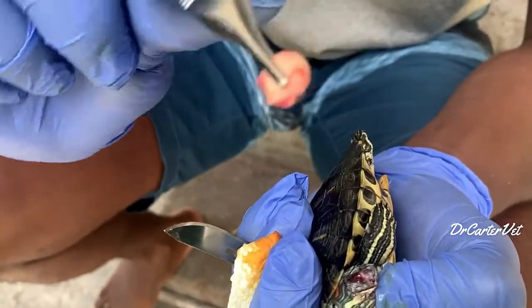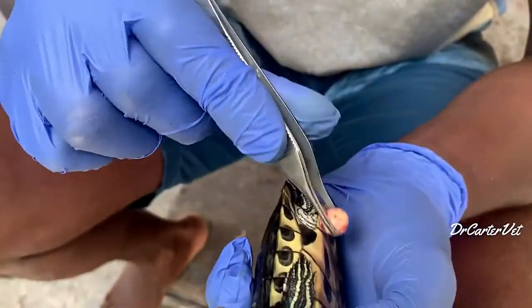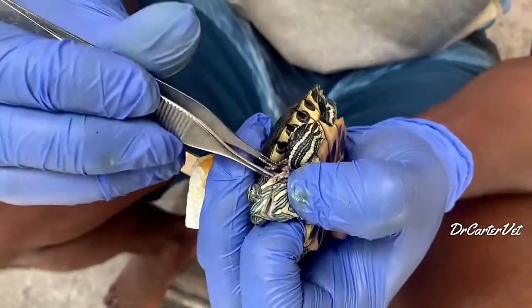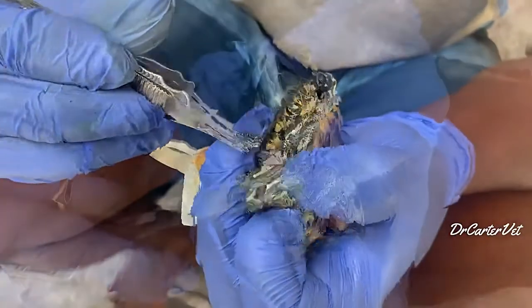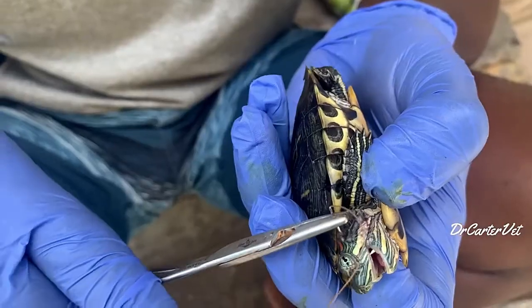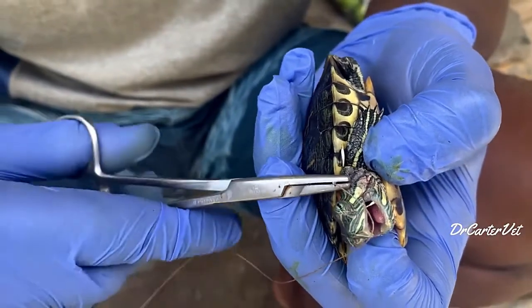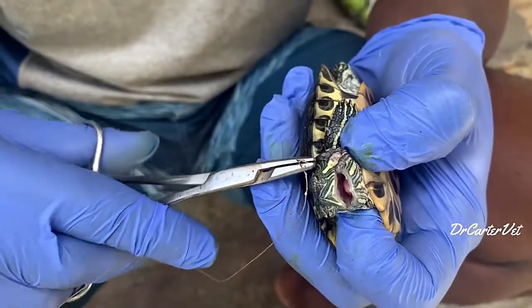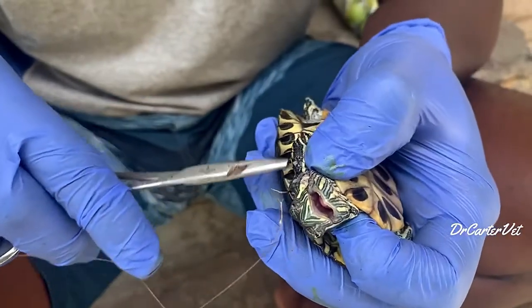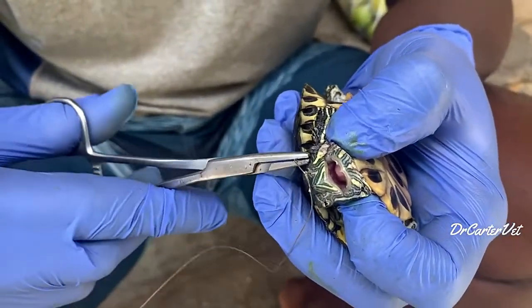It's a perfect ball. You can see the root, and although it's hard to tell from this video, if you look down inside the ear you can see the bone structure that's there. At this point you can do one of two things. I chose to clean it out thoroughly with an antiseptic, give it a good wash, and suture it up.